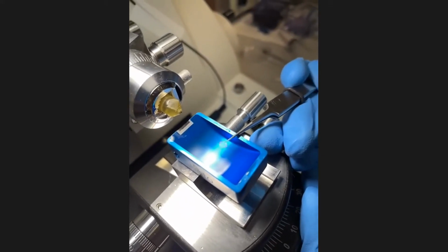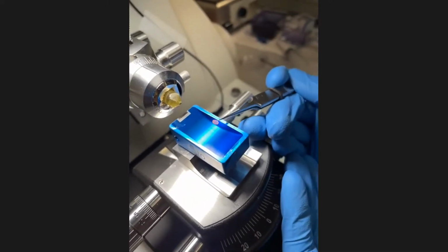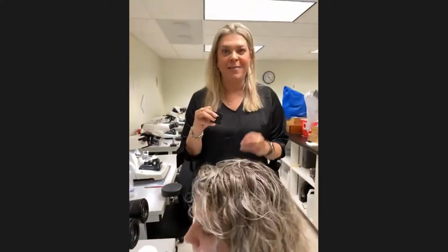And of course, we have the machine with the eyepieces to do that. We're not doing that with our naked eye, because you can't see it with the naked eye. It's so small. And they're looking for something inside the kidney called a glomerulus. That's the thing, the glomerular disease is what we're diagnosing here.